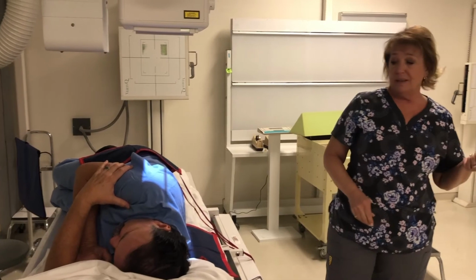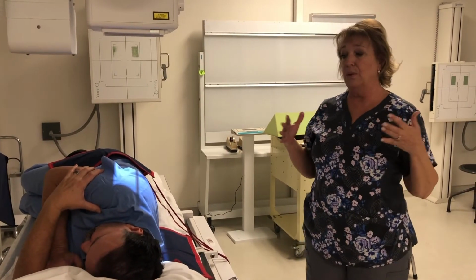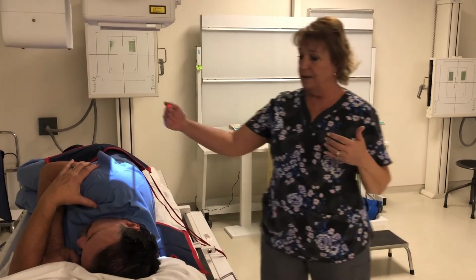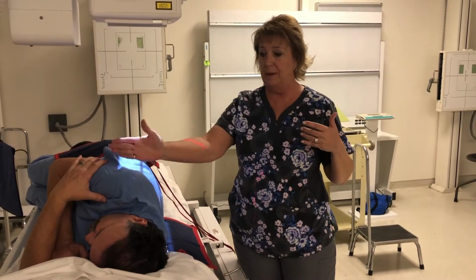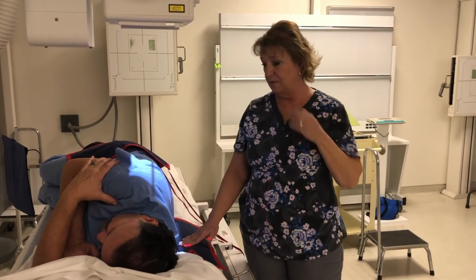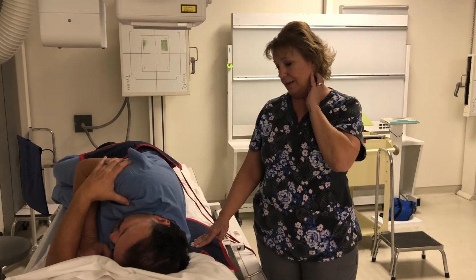We're going to use a breathing technique on this to blur the ribs and allow us to see just the vertebral bodies without that obvious overlap of the ribs. So breathing technique for the lateral thoracic.